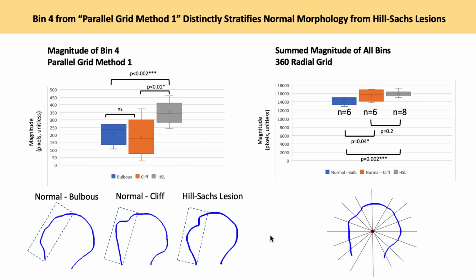And this slide goes to highlight the versatility that the LCPC transform provides for clinicians, because it allows the clinician to define exactly what you're measuring, how you're measuring, and why you're measuring it, which are advantages that current deep learning methods don't provide. Furthermore, unlike deep learning methods that aren't interpretable, our approach allows the clinician to know ahead of time exactly what they're measuring and why they're measuring it. So whatever differences result, those differences are very interpretable.